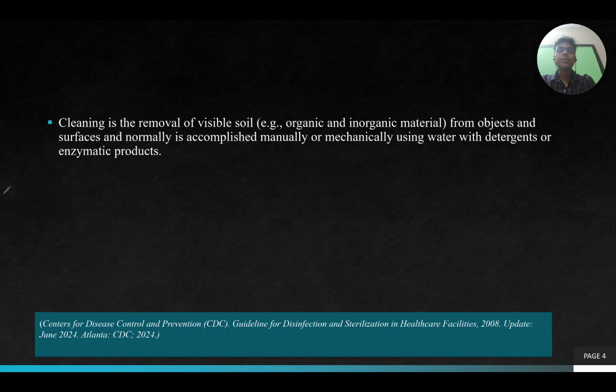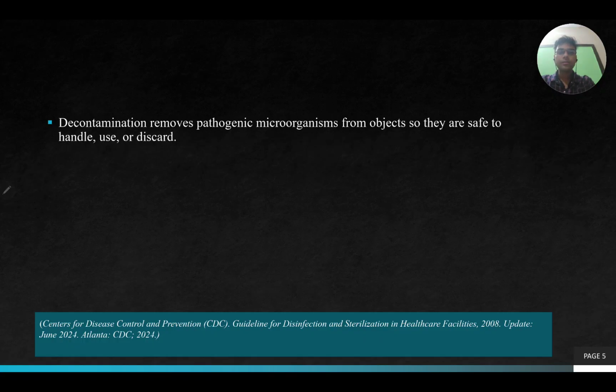Cleaning is the removal of visible soil, organic and inorganic material from the objects and surfaces, and normally is accomplished manually or mechanically using water with detergents or enzymatic products. Decontamination removes the pathogenic microorganisms from these objects so they are safe to handle, use, or discard. All of these definitions have their origin from the CDC guideline for disinfection and sterilization in healthcare facilities.